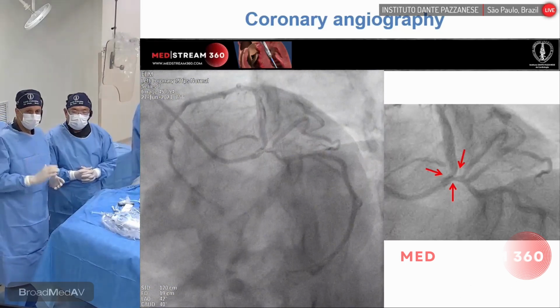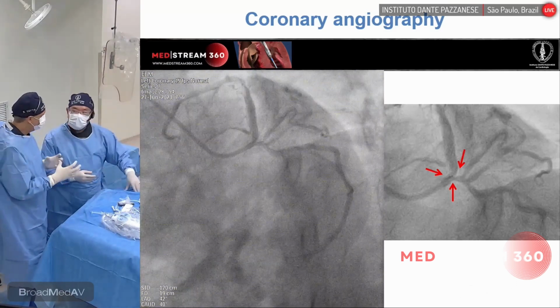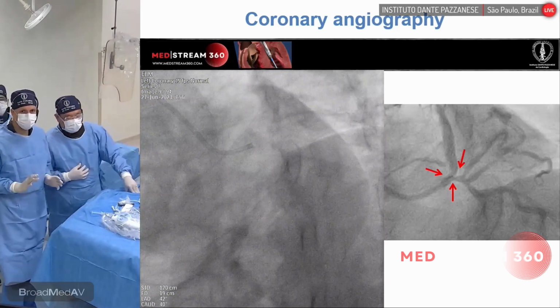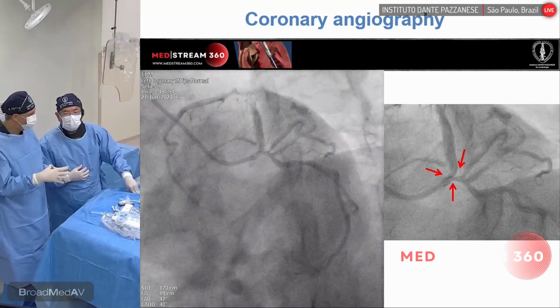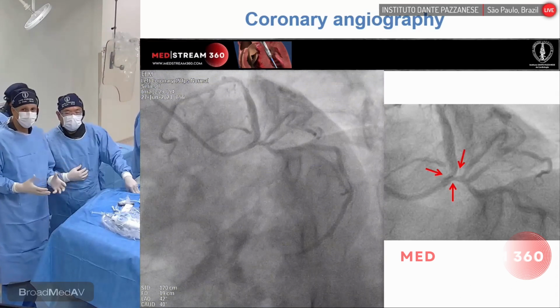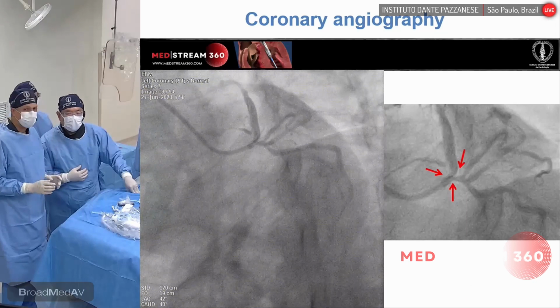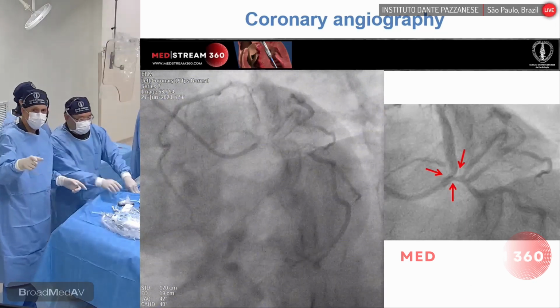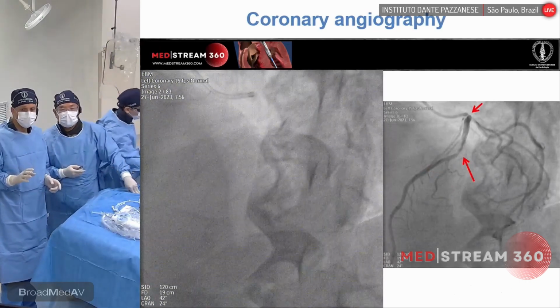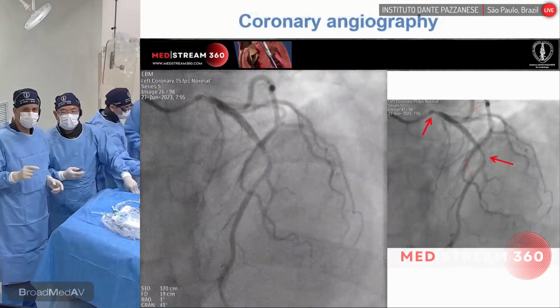Interestingly, when we see the angiographic study, which was done yesterday, it looks to me more like an ambiguous lesion in the left main. I'm not convinced this is a very severe stenosis, but it is somewhat disproportional to the proximal LAD, which is like a 4.0 vessel. Yes. Proximal circumflex, like a 3.5 vessel. You see a relatively small-size left main. Yes. It appears to me, if you can go back one, yep, the cranial view, it looks like a severe stenosis in the mid LAD, and now move to the spider again.